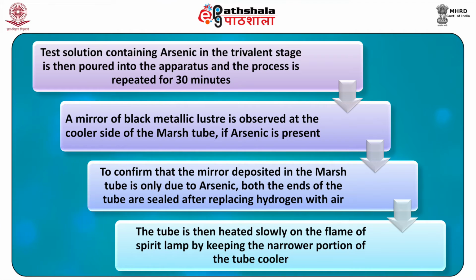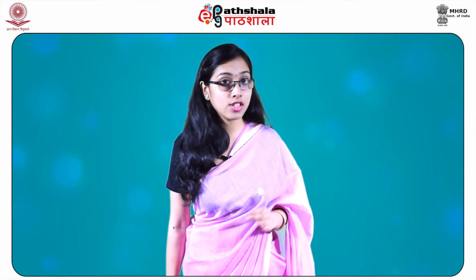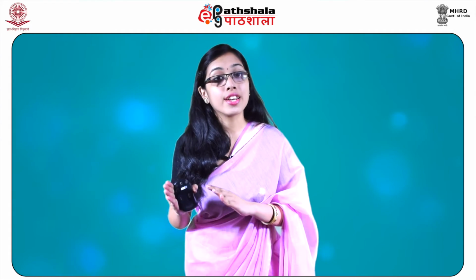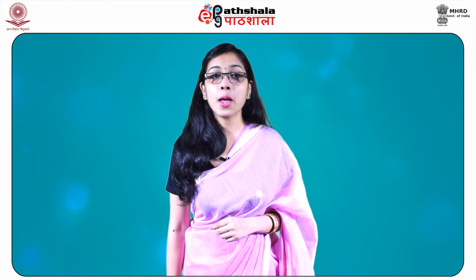To confirm that the mirror deposited in the Marsh tube is only due to arsenic, both the ends of the tube are sealed after replacing hydrogen with air. The tube is then heated slowly on the flame of a spirit lamp by keeping the narrower portion of the tube cooler. The mirror disappears and the octahedral crystals of arsenous trioxide get deposited on the cooler, narrower end of the tube, which is then identified under the high power of the microscope.